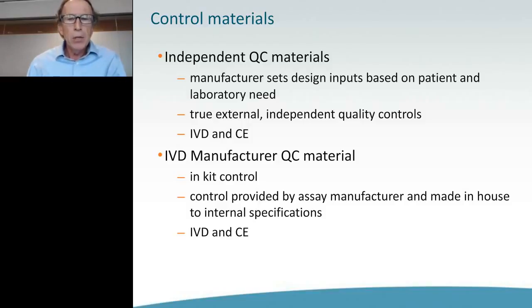IVD manufacturers also supply QC material, and let me state here that we do not recommend replacing in-kit controls with our third-party controls. You should always run the in-kit controls as recommended by the manufacturer as well. The IVD manufacturer makes in-kit controls. Generally, they're designed to work as a system by the manufacturer of the instrument and the assay design. They're made in-house to internal specifications and usually have IVD CE marks as well.